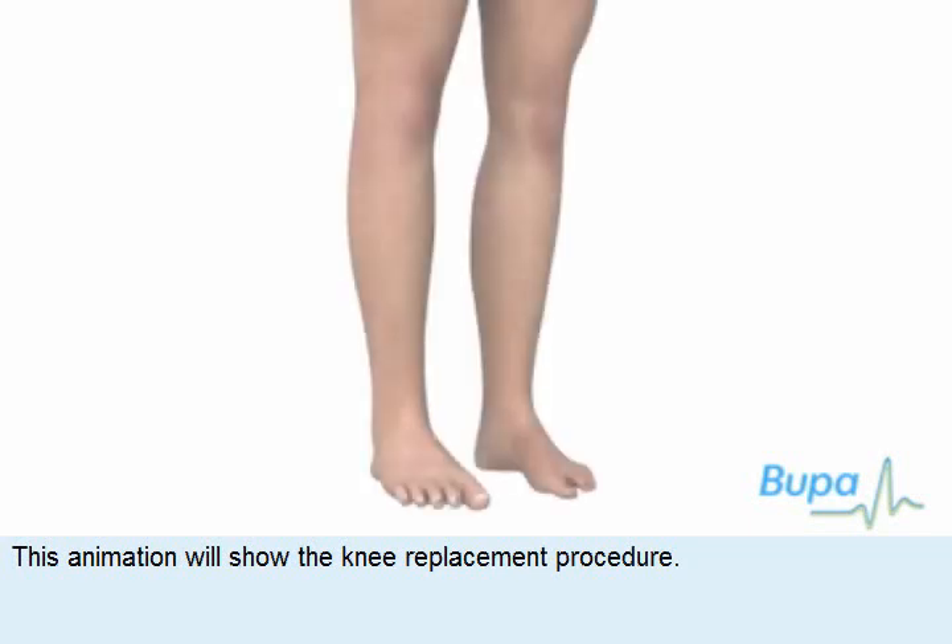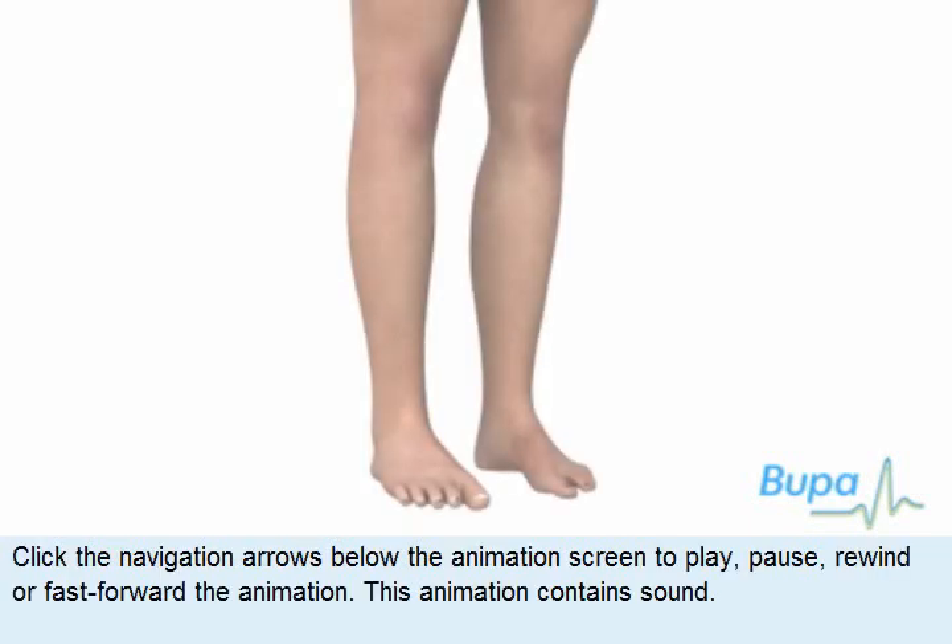This animation will show the knee replacement procedure. Click the navigation arrows below the animation screen to play, pause, rewind or fast-forward the animation.